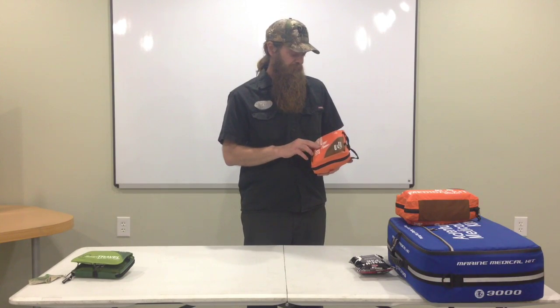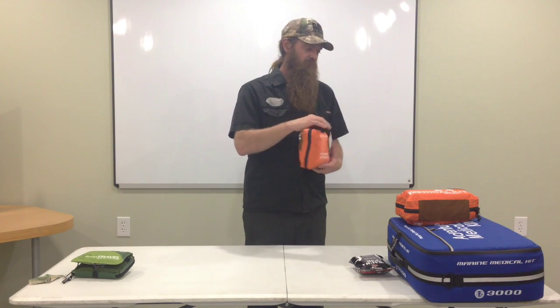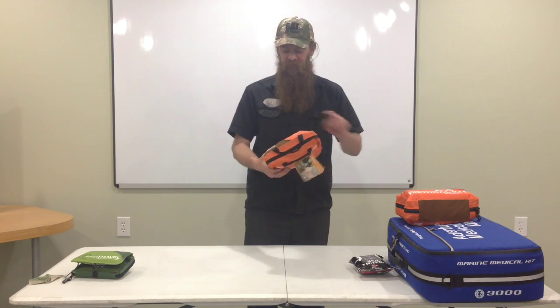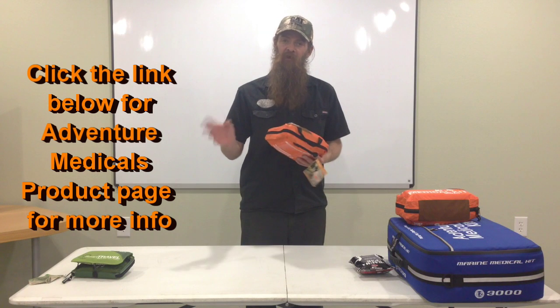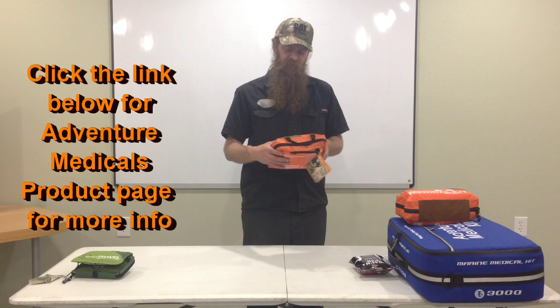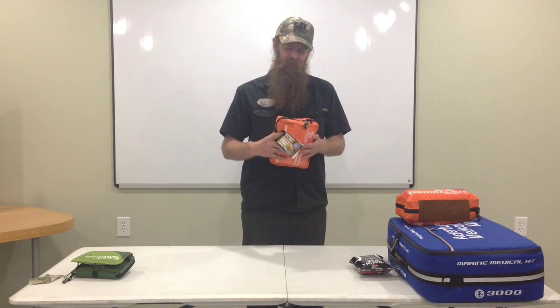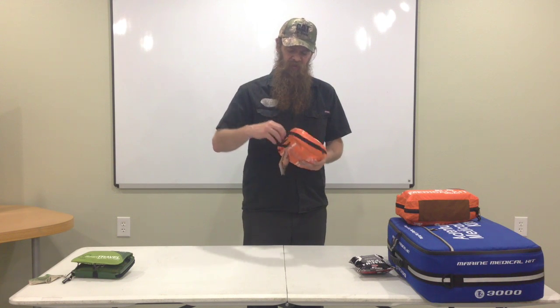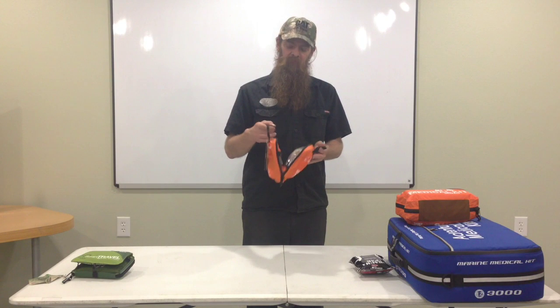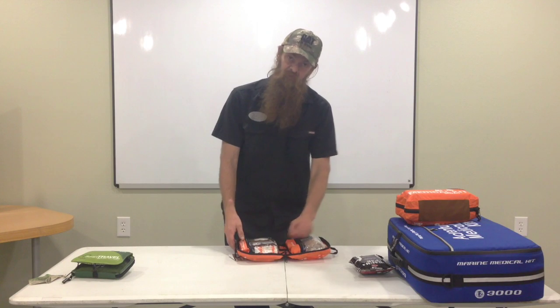This is the Bighorn Kit. It's one of the middle-sized Sportsman Series kits. There's the Grizzly, the Bighorn, and then there's the Whitetail. The Whitetail was smaller and didn't have as much stuff. This middle one I figured would be good for carrying around in a pickup truck or a vehicle while we're out working over the land to get our farm ready.